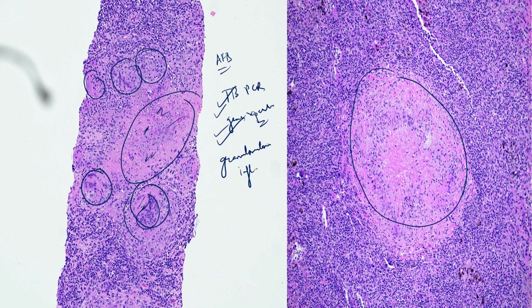So never write diagnostic of tuberculosis. Always write suggestive of tuberculosis. That's the art of histopathology. You suggest only, to be confirmed either by immunohistochemistry or by further molecular studies like PCR, GeneXpert, PCR techniques. That's what they are for. So use them, suggest them in your report.